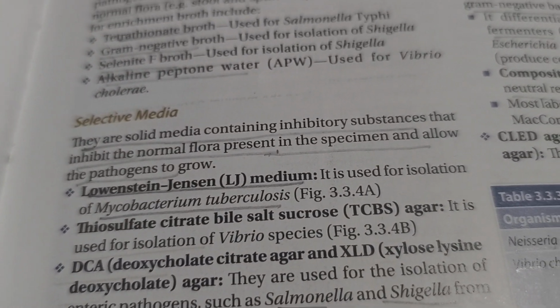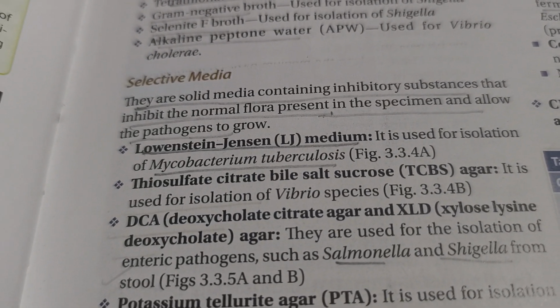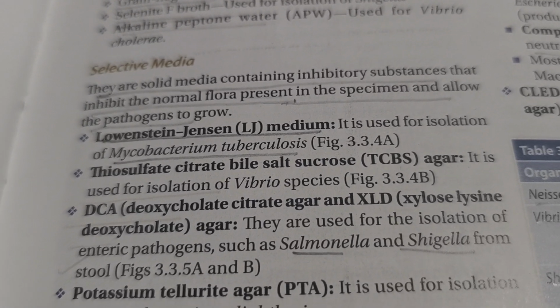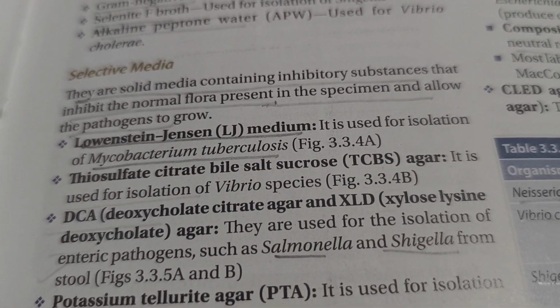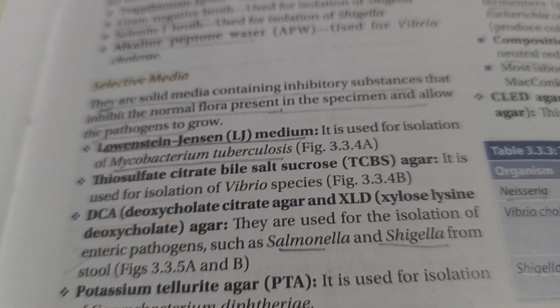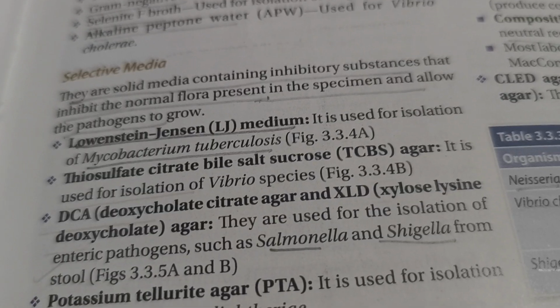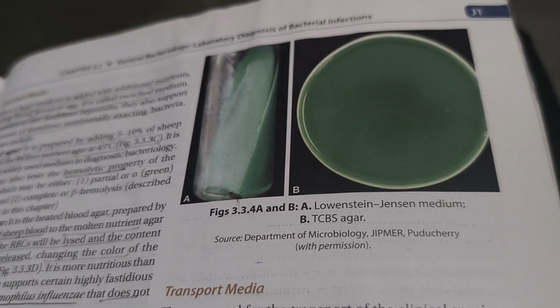For example, Lowenstein-Jensen media, which is used for isolation of Mycobacterium tuberculosis, thiosulfate citrate bile salt sucrose, TCBS agar, which is used for isolation of Vibrio species, DCA, deoxycholate citrate agar, and XLD, xylose lysine deoxycholate agar, which is used for isolation of enteric pathogens, for example, Salmonella and Shigella from stool, potassium tellurite agar, used for isolation of Corynebacterium diphtheriae.